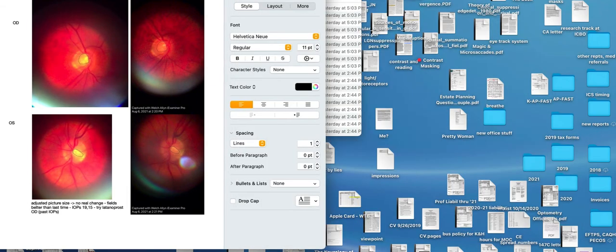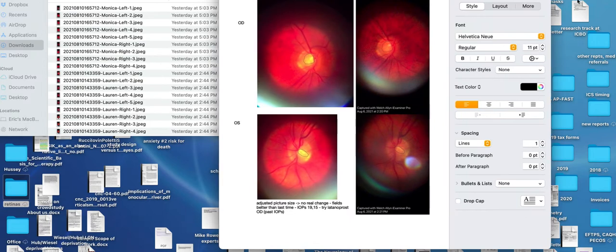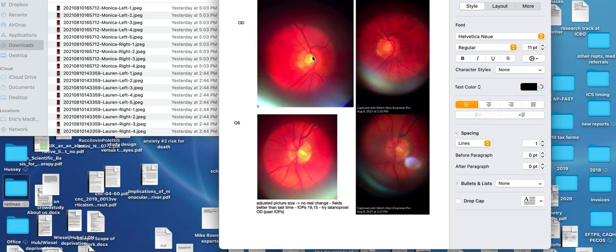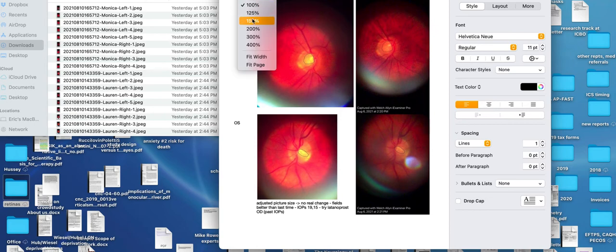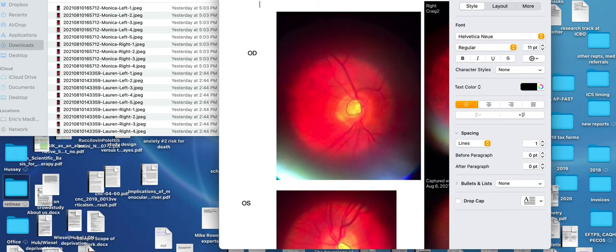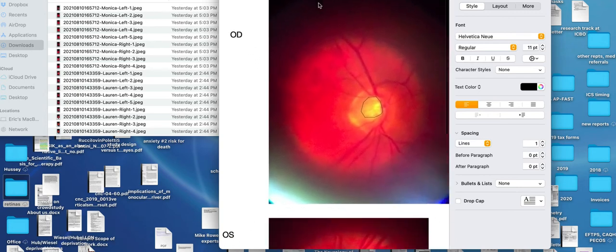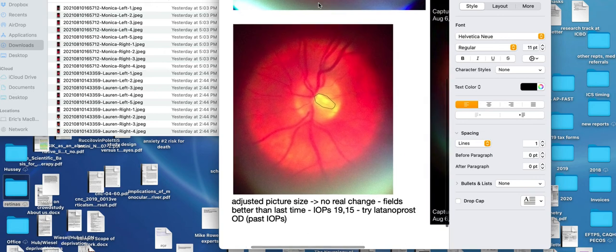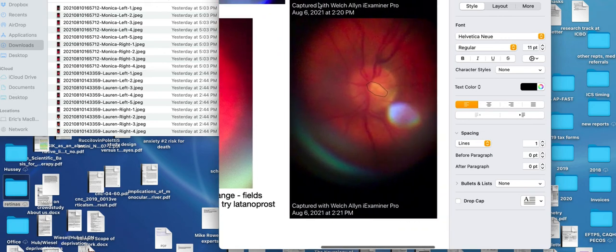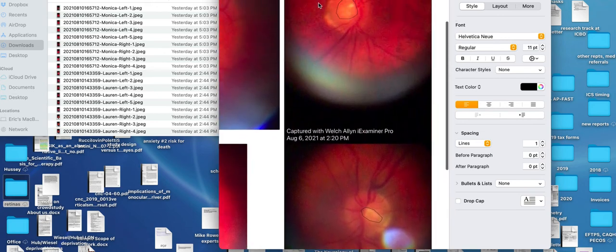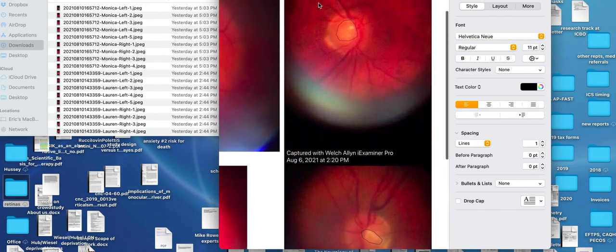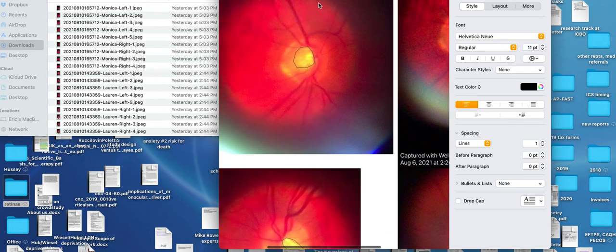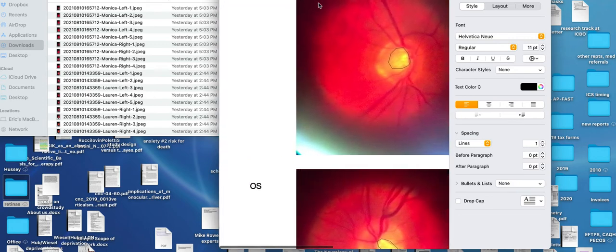One more of those, and I'll show you how I download and all that stuff. Same deal. I've made an outline. Let me make that a little bigger for you. I made an outline of the cup, and then I can compare straight across to the newer pictures. Not perfect, but it gives us an idea of what's going on.